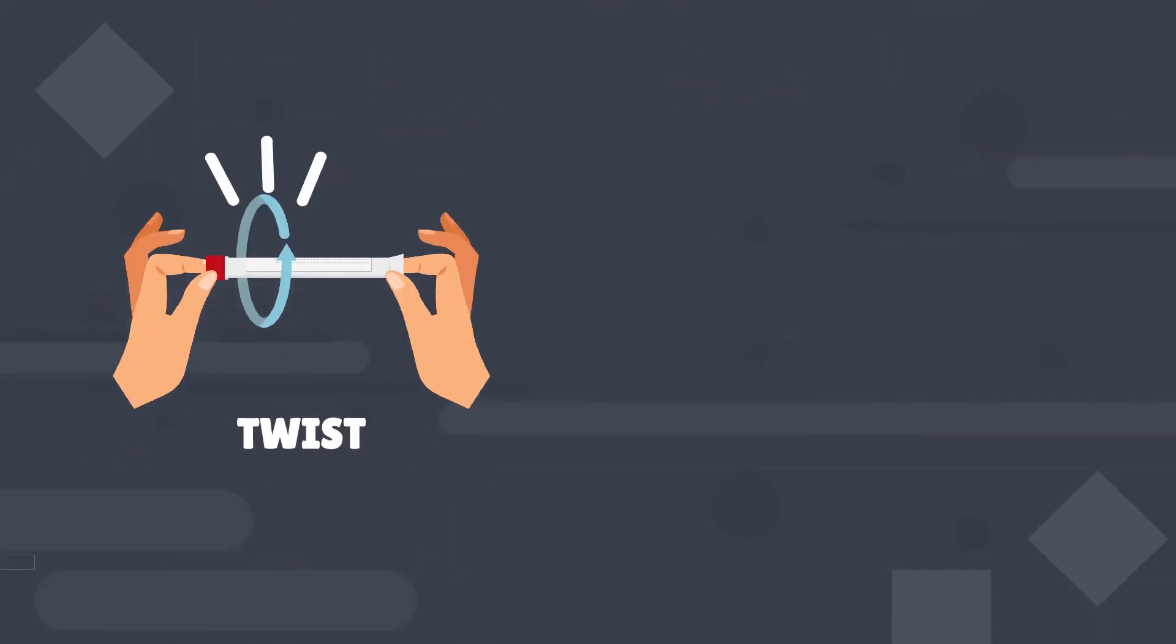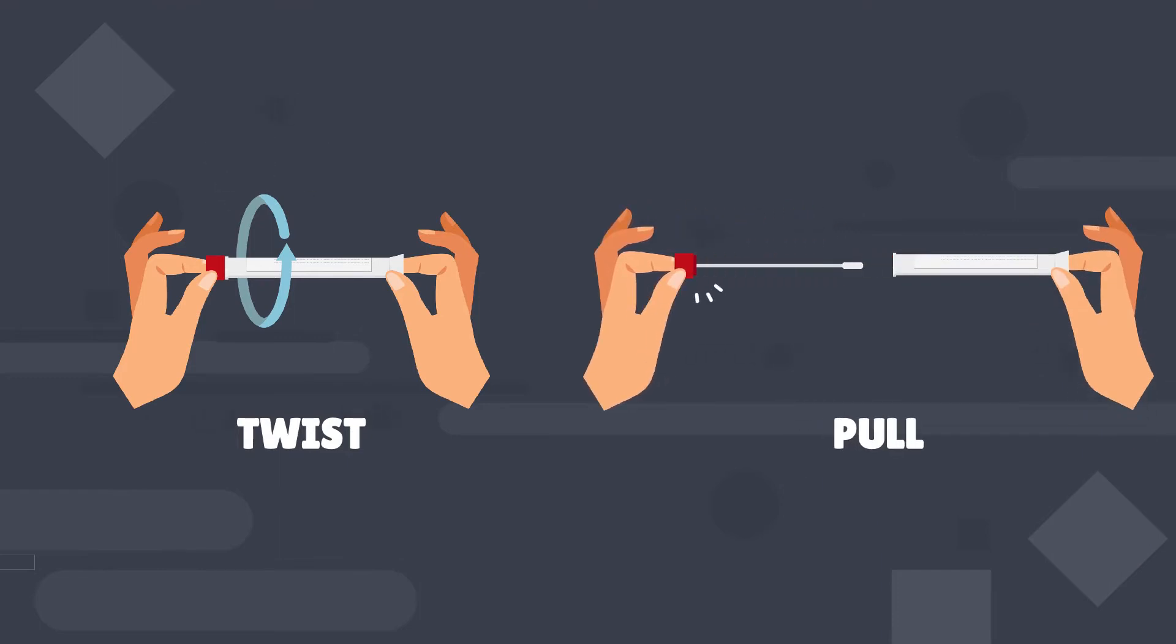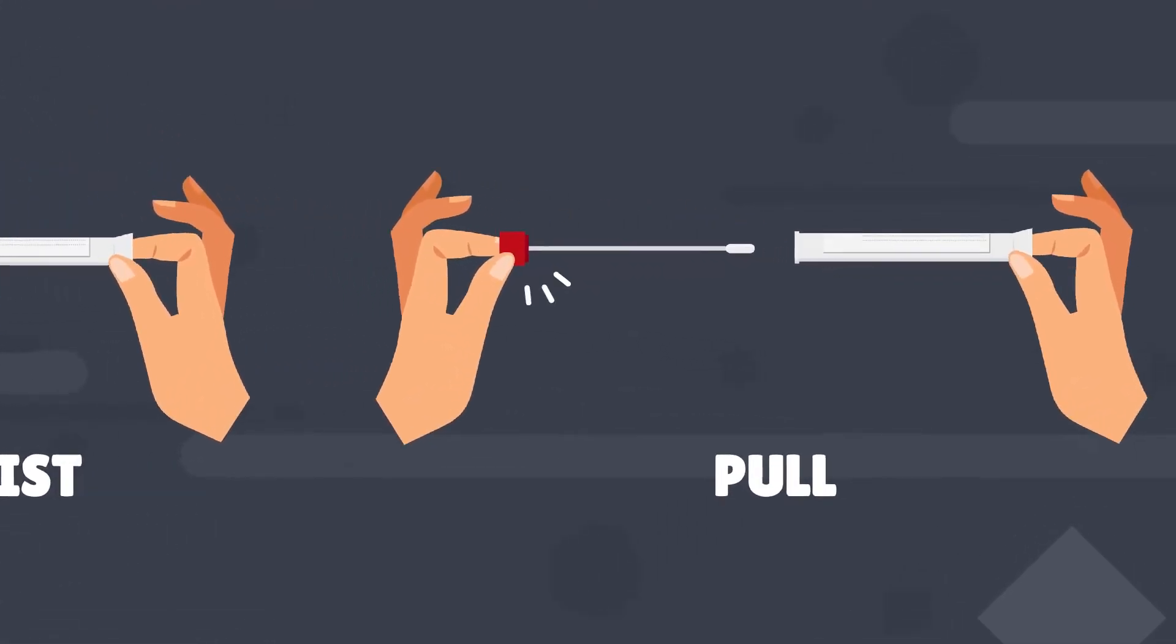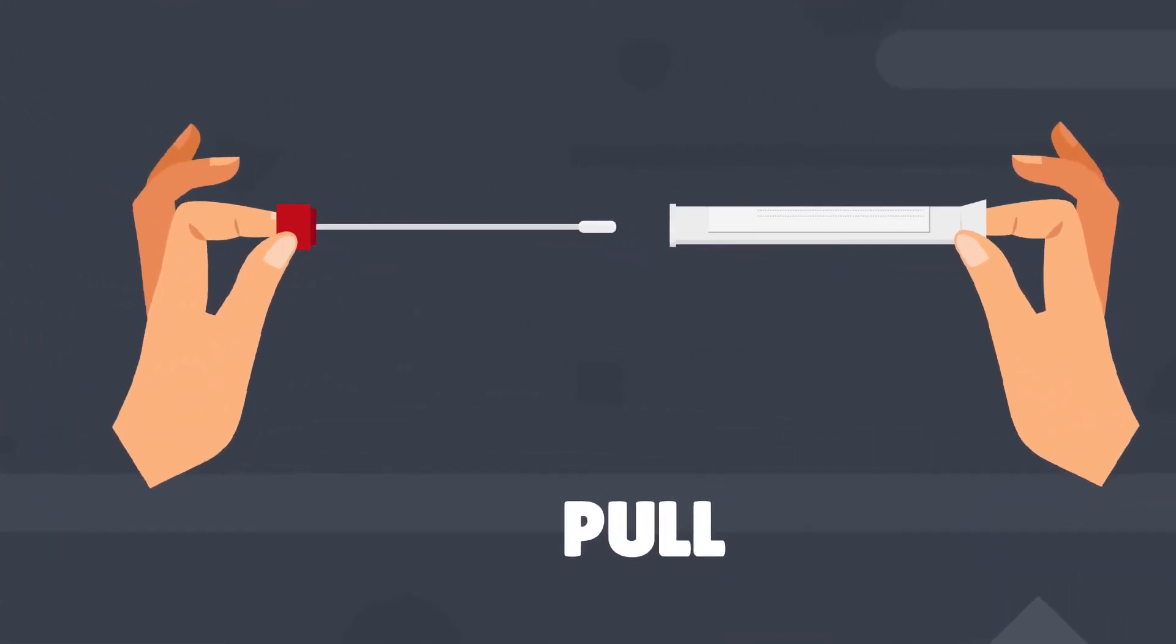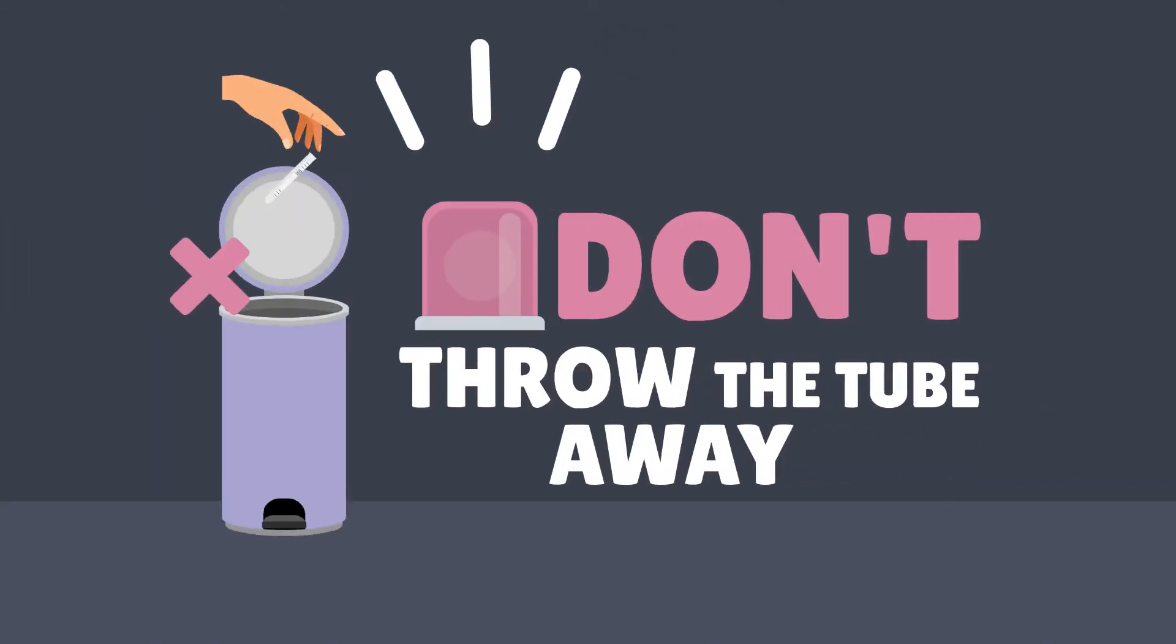Then pull. The swab is attached to the cap and stays attached. Remember, don't throw the tube away. You'll put the swab back in it after you've collected your sample.